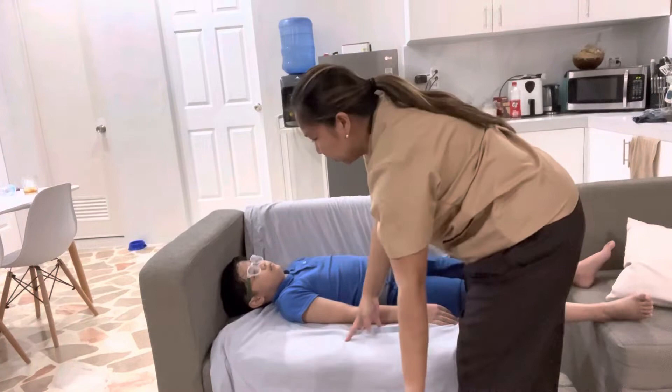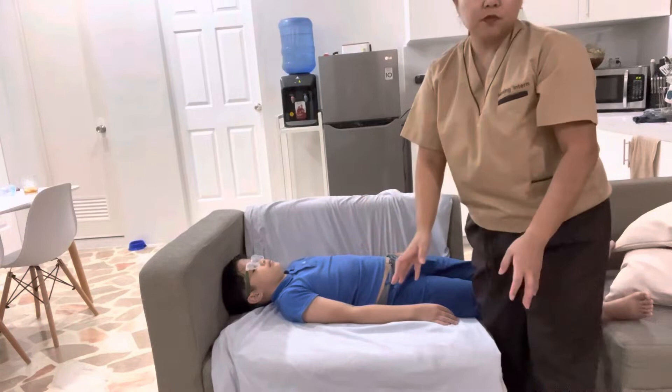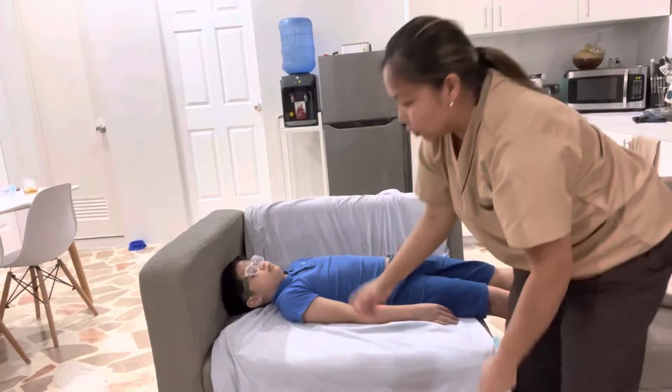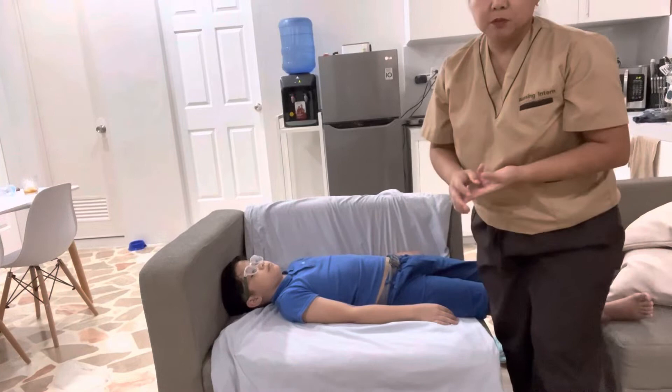I would then get the stretcher parallel to the bed. Just make sure that you raise it to the height of the bed and that the side rails of the stretcher are down. You would also like to ask for help from your coworkers or another healthcare provider — we need about two more people to do this procedure.